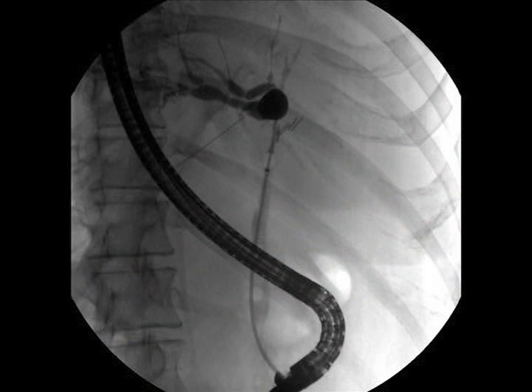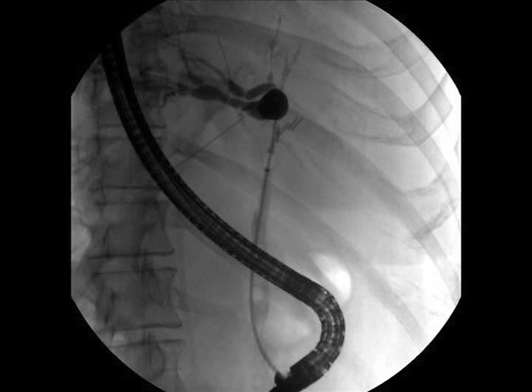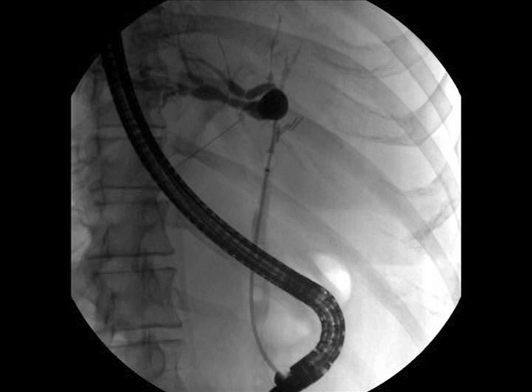This patient had a more concerning common hepatic duct stricture with significant intrahepatic ductal dilation on the left side. The cholangioscopy demonstrated a fungating lesion within the bile duct lumen. Multiple forceps biopsies were obtained, and these revealed cholangiocarcinoma.